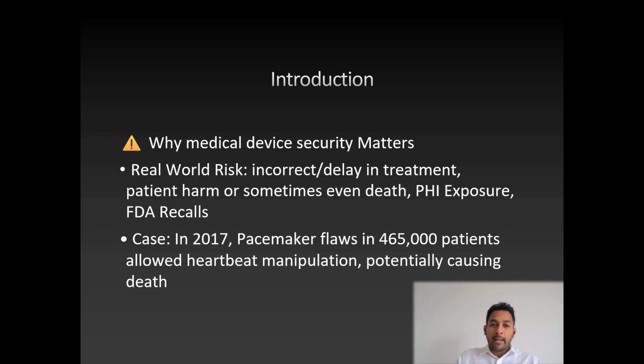Let's look at a real case here. In 2017, there was a pacemaker that was implanted in almost 500,000 people. There was a vulnerability that allowed an attacker to change the heart pace remotely. They could even drain the battery by successfully exploiting these vulnerabilities. The exact details of this vulnerability were not disclosed, but the fix was eventually released.